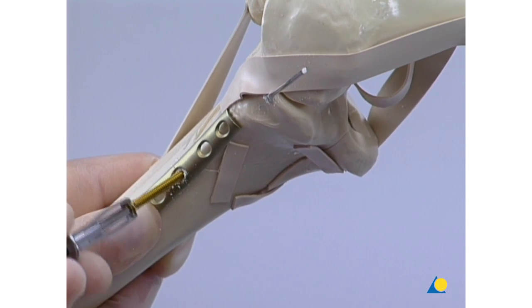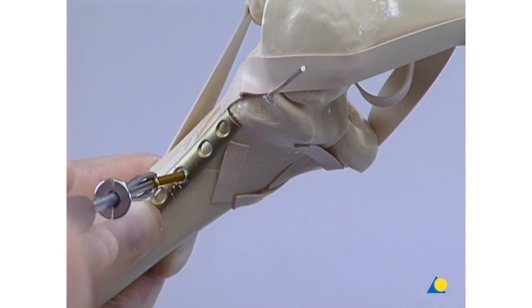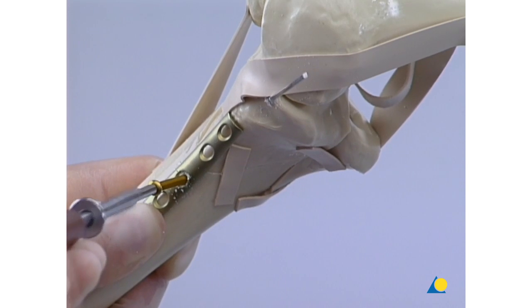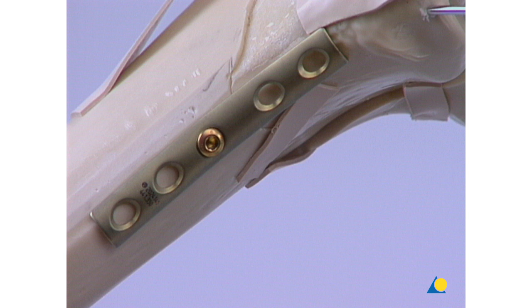A cortex screw is inserted through the middle hole of the plate. This maneuver pulls the plate into its anti-glide or buttress position, thereby reducing the fracture indirectly.